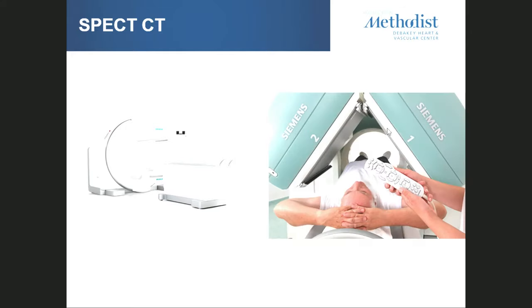With SPECT, another difference is that if you notice a patient being imaged, the camera is going to rotate around the patient. The patient is on a table, and then the camera will make an arc around the patient. So from an outside view, these are very different from what we do with PET.